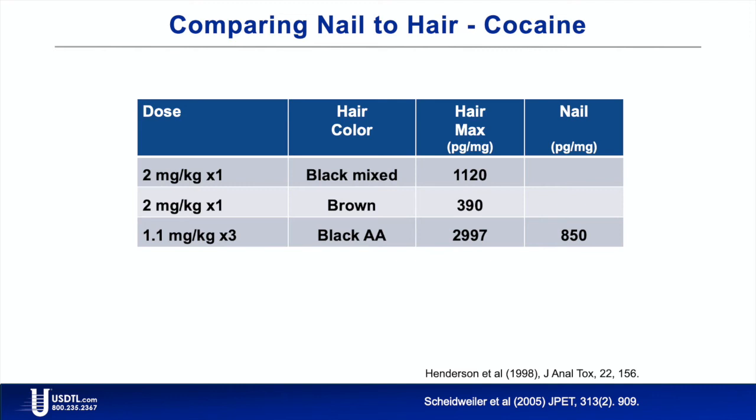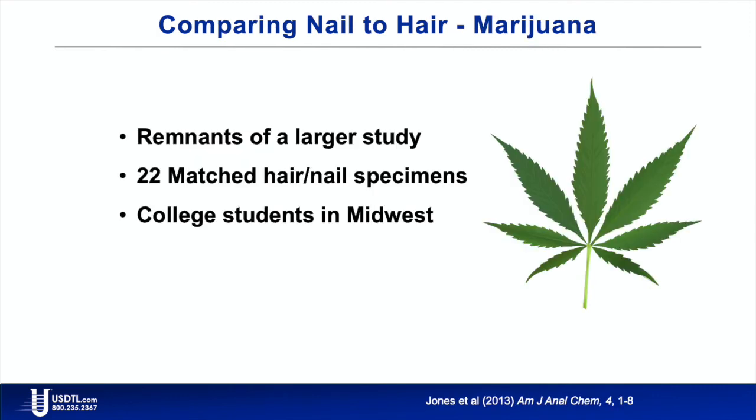Now, that's a big variable when it comes to testing for alkaline compounds. Again, the amphetamines, which includes methamphetamine, the opiates, the PCP, and a lot of the other compounds that we look for in our 17 panel. This phenomenon, or this observation, does not apply to acidic drugs. The most prevalent acidic drug that we look for is marijuana. Carboxy-THC is slightly acidic, and so the interaction between an acidic drug and the melanin is non-existent, and that's been demonstrated in many studies. So for marijuana, hair color is not a variable.